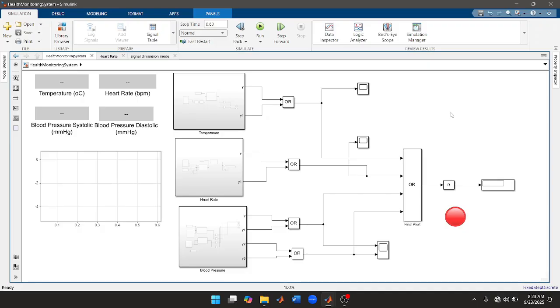So this is a simple health monitoring system. You can use it to measure temperature, heart rate, blood pressure, the systolic and the diastolic. Now, this system has two ways of giving output. It can output the raw reading for the temperature, heart rate, and blood pressure, and also give you the signal waveform. You can also send an alert, a beep, or a light signal to the healthcare giver or to whoever is in charge.